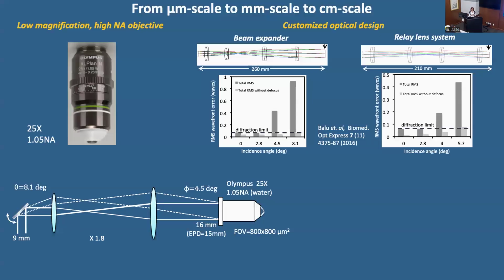So that tells us that when we scan large angles, our images have some curvature. You're at a slightly different depth on the side of the image compared to the center of the image. But because we image in thick tissue, that was an optical aberration we can live with, and besides, it can be corrected for if we are interested.